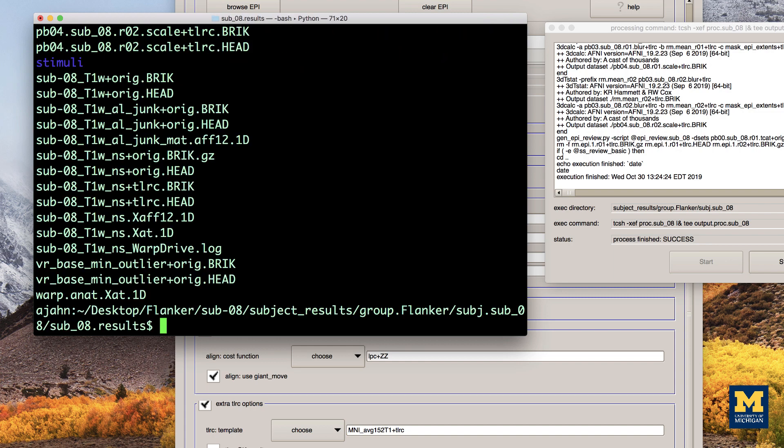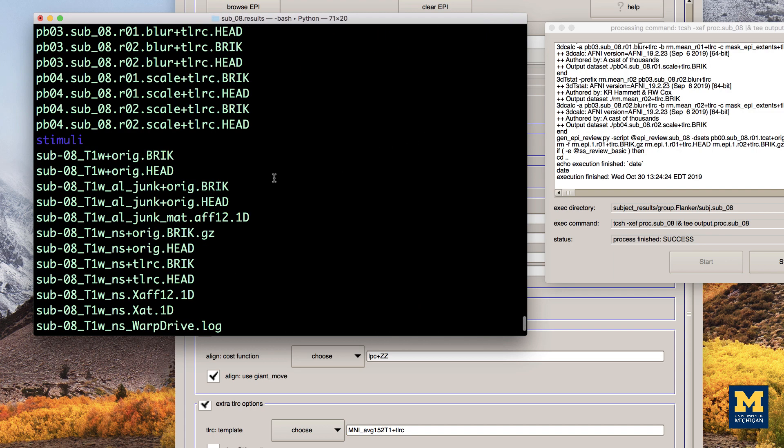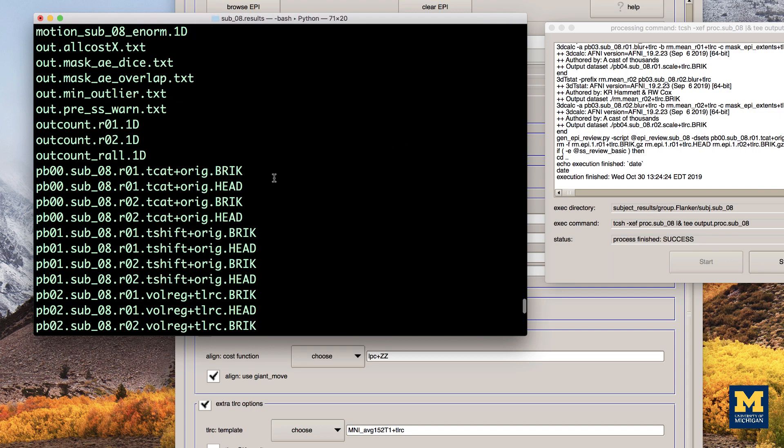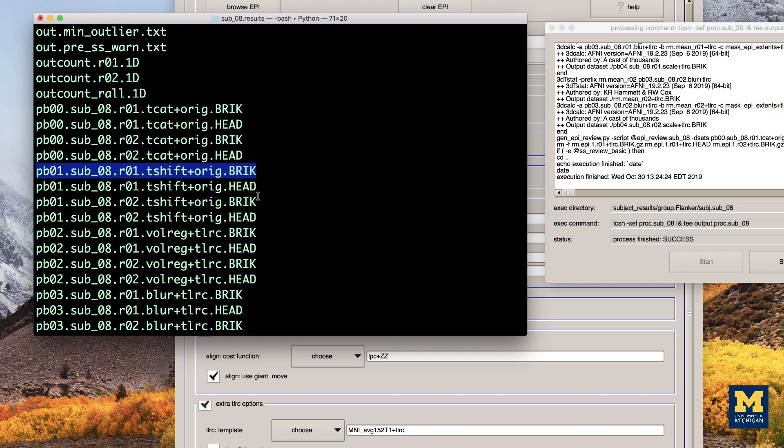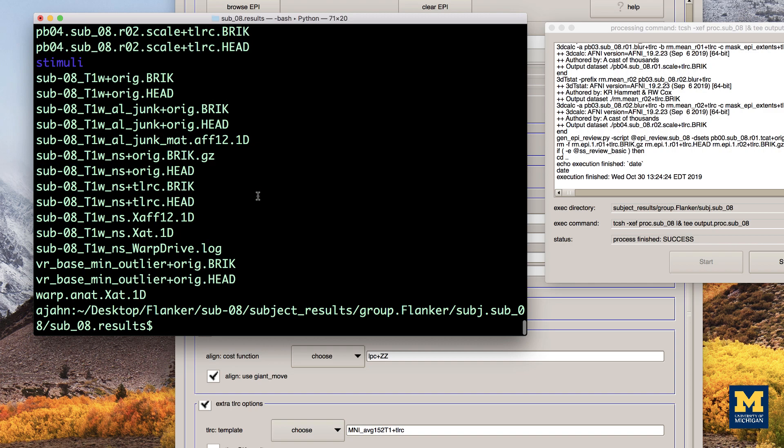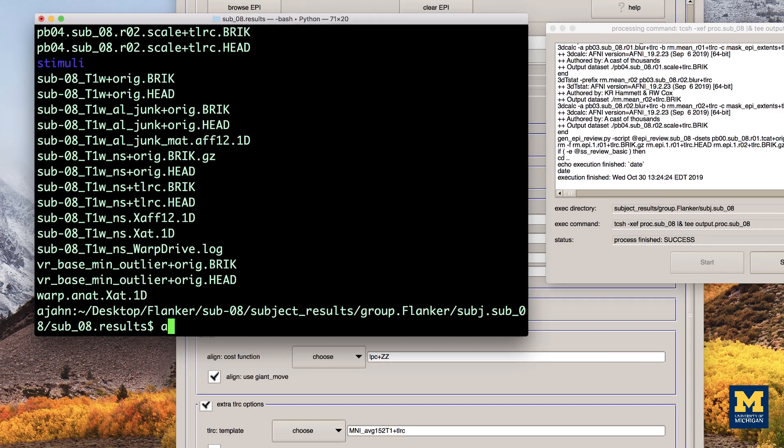This directory contains different versions of the images after each preprocessing step. For example, the files that contain the string pb01, or processing block 01, and the string tshift indicate that these images have been slice time corrected using the 3D tshift command.